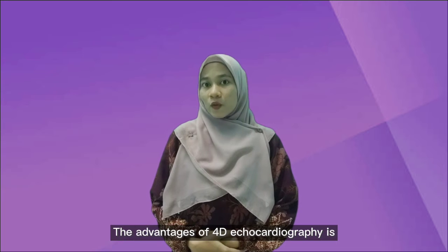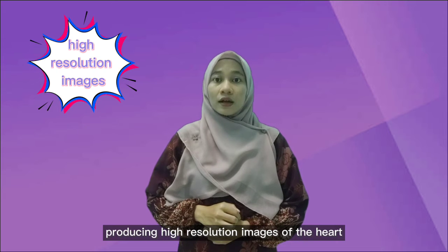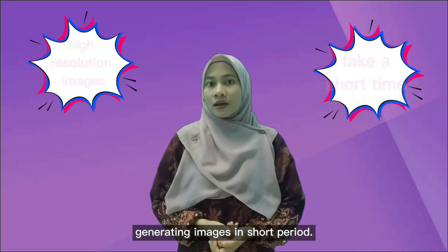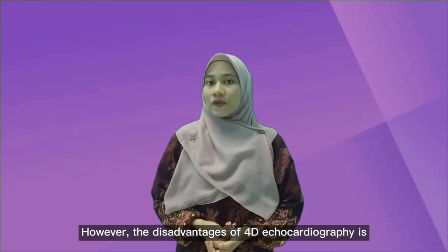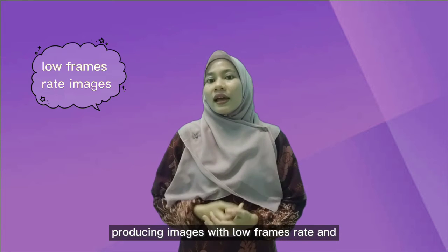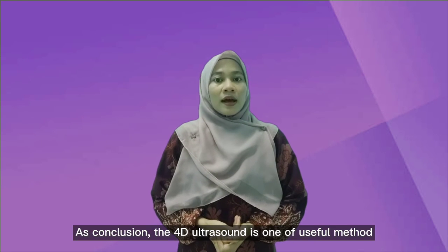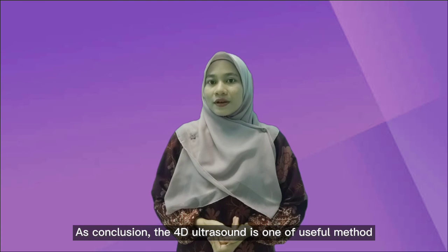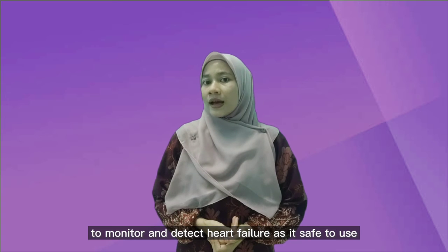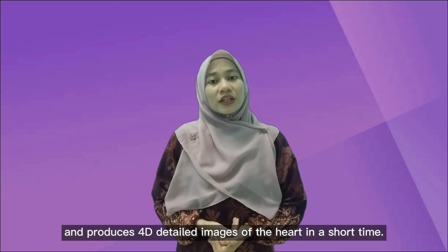The advantages of 4D echocardiography are producing high-resolution images of the heart compared to 2D echocardiography and generating images in a short period. However, the disadvantages of 4D echocardiography are producing images with low frame rates, and images are limited by anatomical criteria like obesity. In conclusion, 4D echocardiography is one of the useful methods to monitor and detect heart failure, as it is safe to use and produces detailed 4D images of the heart in a short time.